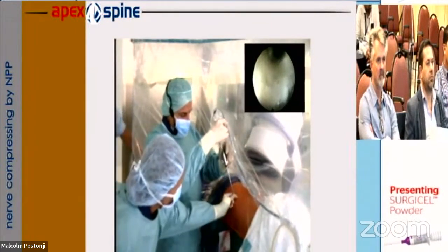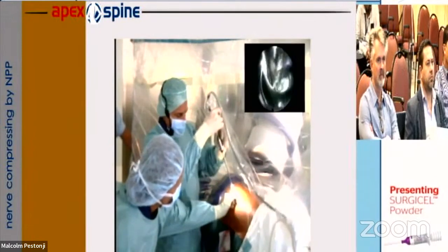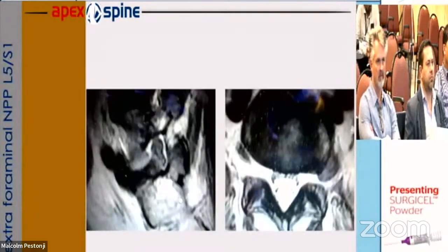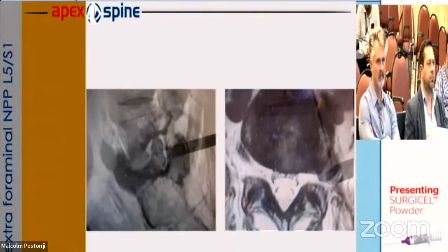Now you can see it. Okay. Removed everything in total. Okay. Yeah, here we have an extraforaminal disc herniation L5-S1. It's also an easy case. Again, the control of my forceps.